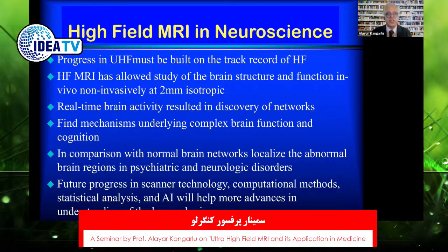So all of these different engineering techniques that have been brought to us allow us to really stand up to the challenges of these issues, the limitations imposed by the need for fast imaging, such as the washout rate. So we can deal with it by acceleration, and we can deal with it by going to contrast agents that have longer blood circulation life and half-life. So by a number of different techniques, we can actually get those contrast agents to do their job by enhancing the contrast at the site of pathology.